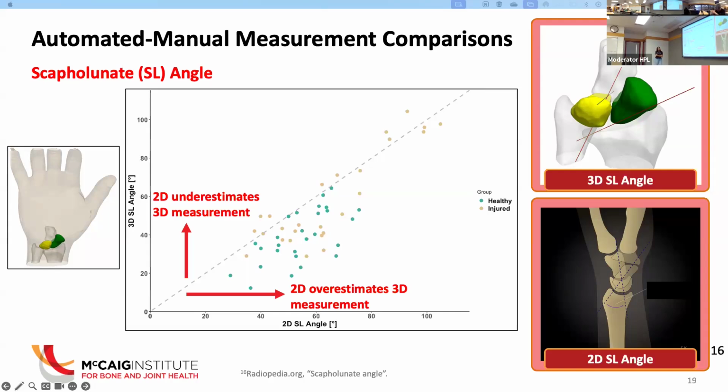I think from a diagnostic standpoint it doesn't add as much value, because we saw significant differences between the healthy and injured individuals mostly in those unloaded positions. I think it will be more important in surgical planning. For example, that screw you saw inserted between the two bones, it's going to be more important there, in understanding how the bones are going to shift when you apply a load.